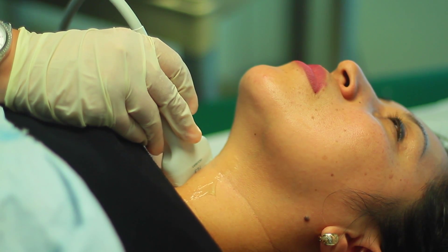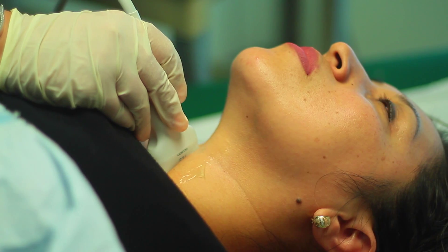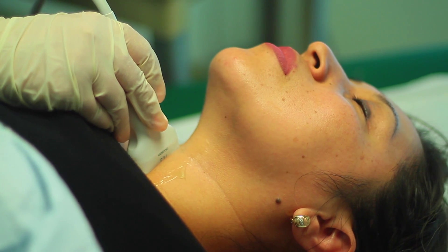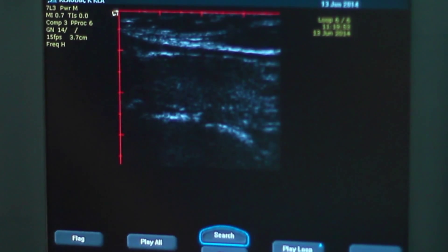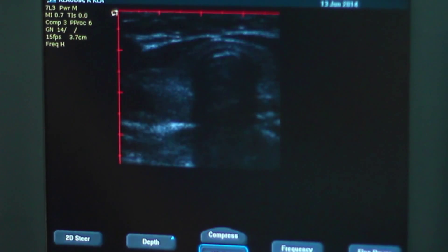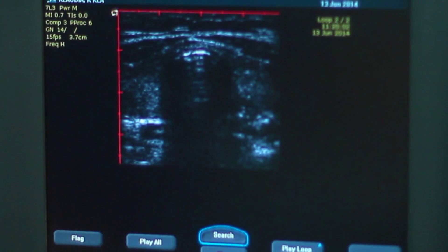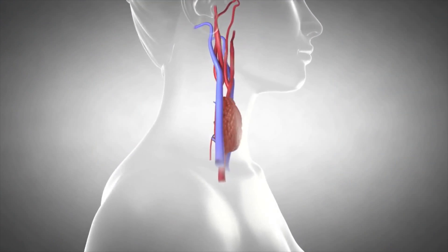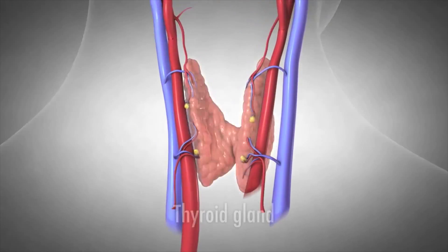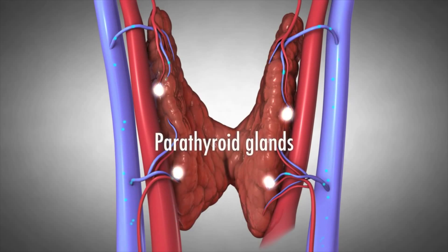The ultrasound produces images of the thyroid gland in patients with swelling or dysfunction such as lumps, cancer, Graves' disease, hypothyroidism, or Hashimoto's disease. The thyroid may become enlarged or inflamed as a result of these conditions and therefore may require regular monitoring.